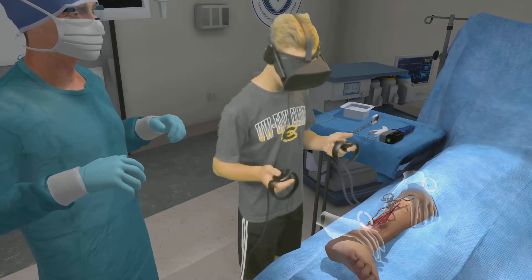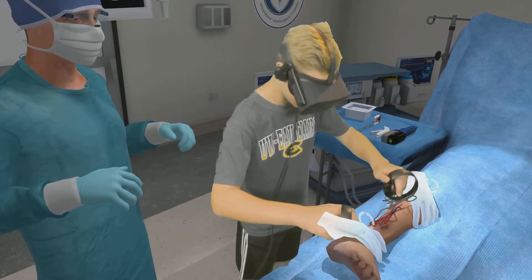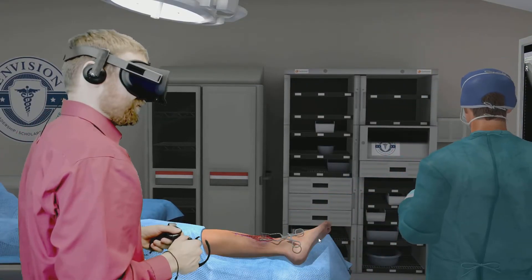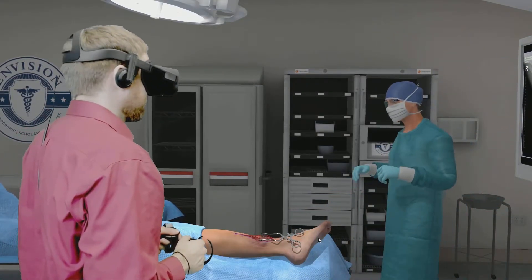Find the bone and approximate the fracture. You will secure the fractured bone in place by affixing a metal plate over the fracture screw.